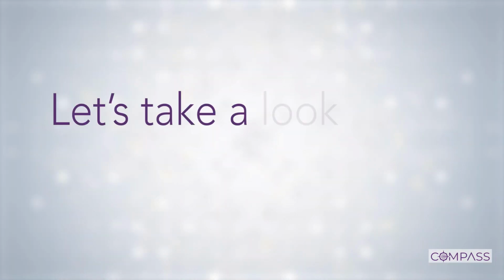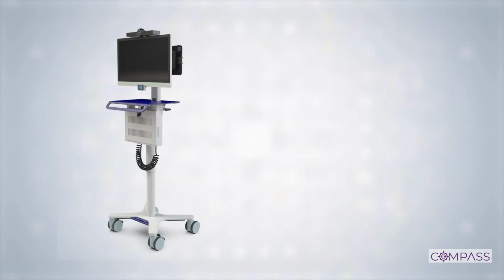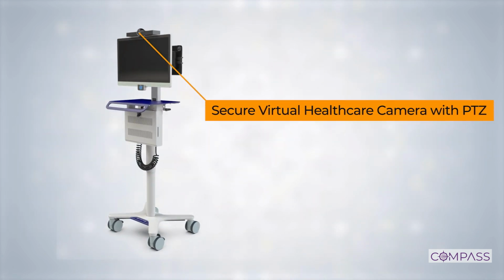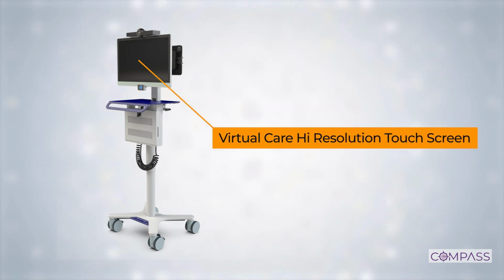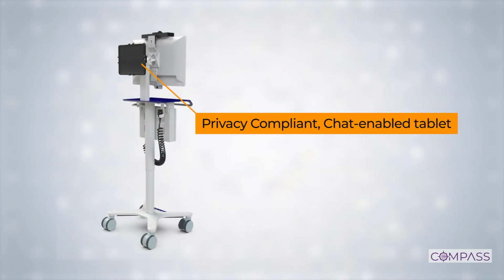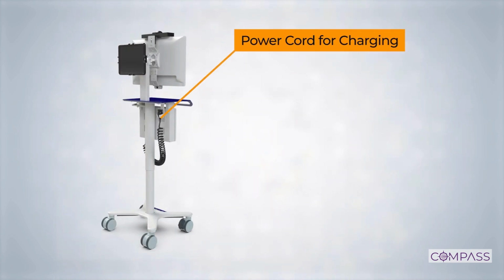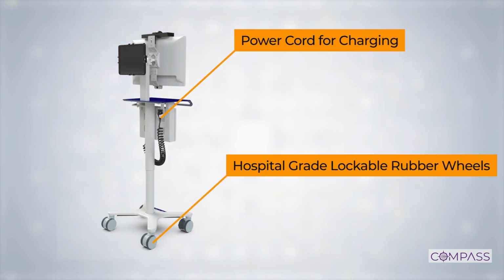First, let's take a close look at the main cart components. Each Compass cart is equipped with the following: a high-resolution camera with motorized lens, a large touchscreen display, a Bluetooth-connected digital stethoscope, a small touchscreen provider communication tablet, a cabinet housing an 8-hour battery, a power cord for easy charging, and 4 lockable rubber wheels.